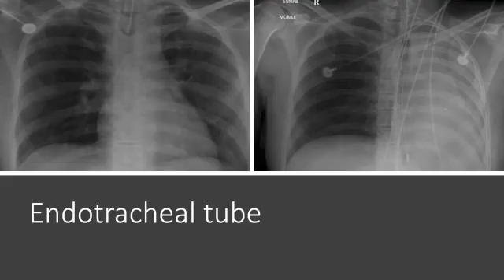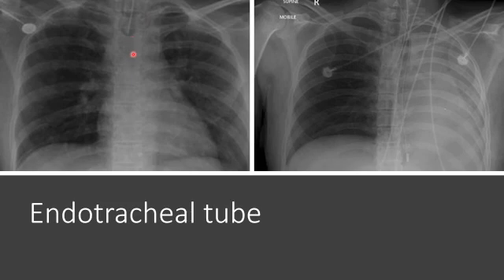The most important tube on the chest x-ray is the endotracheal tube. On the first image you can see an appropriately placed ET tube — it should be about five centimeters above the carina, plus or minus two centimeters, so find the carina and measure from there. On the second image, the endotracheal tube was placed into the right main bronchus, resulting in complete collapse of the left lung.